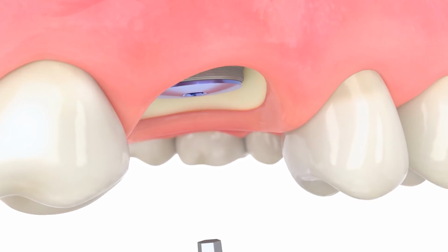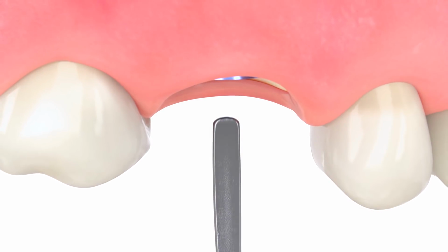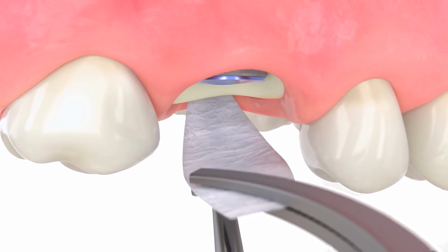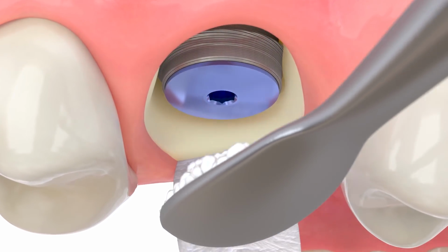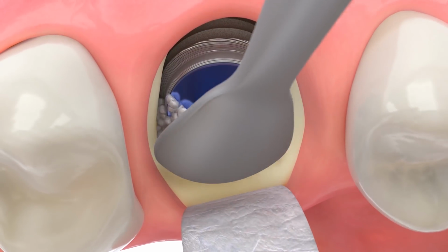Complete the surgery by grafting with bone particulate and barrier membranes. Begin by tucking a Memlock collagen membrane under the soft tissue at the palatal side of the extraction socket. Fill any remaining voids surrounding the implant body with Mineros bone particulate.